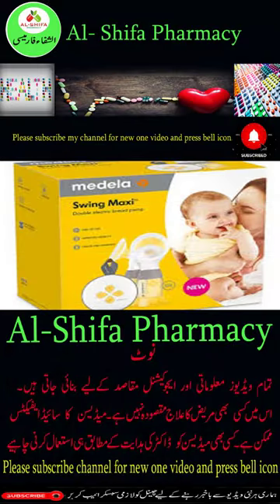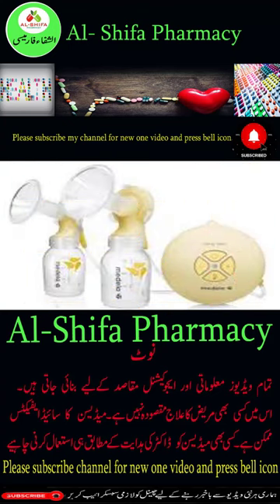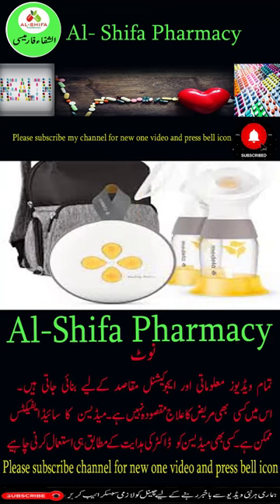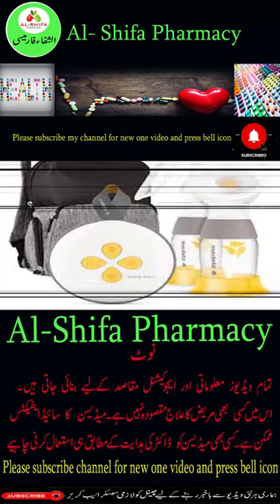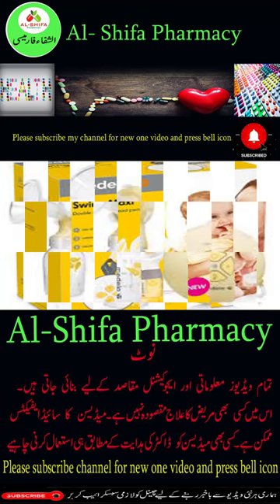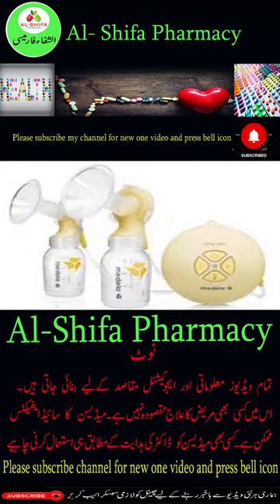The Medela Swing Maxi Double Electric Breast Pump is an electric pump used to increase or maintain a nursing woman's milk supply. It is also used to relieve engorged breasts, unblock plugged milk ducts, and pull out inverted or flat nipples so a nursing baby can suck the milk with ease.